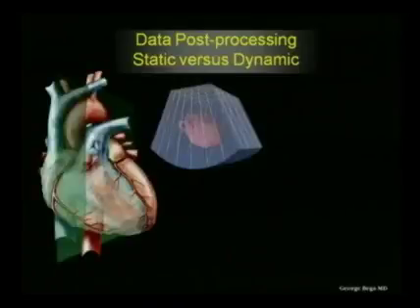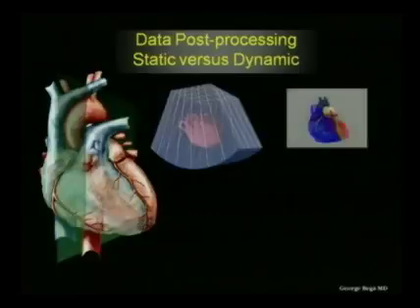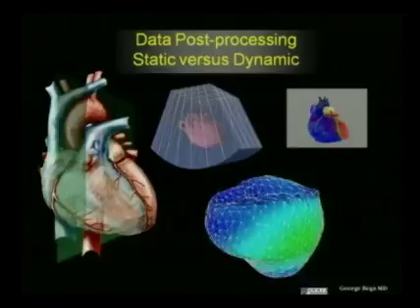Of course, some of the main technologies that involve cardiac scanning have had a hard time being introduced in clinical practice. One of the earliest ways to get fetal hearts used to be a static 3D volume acquisition. That was hard because as the heart beats, grabbing a single volume of the heart, you're basically getting an averaging of peak systole and then diastole.